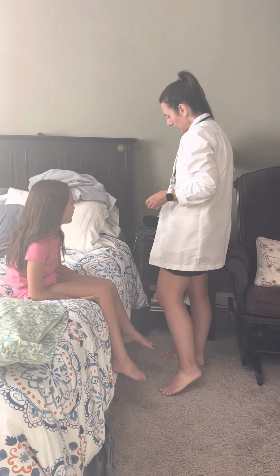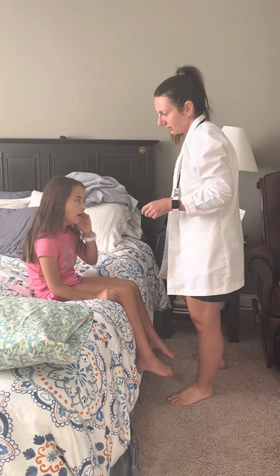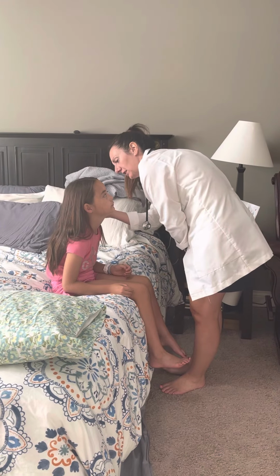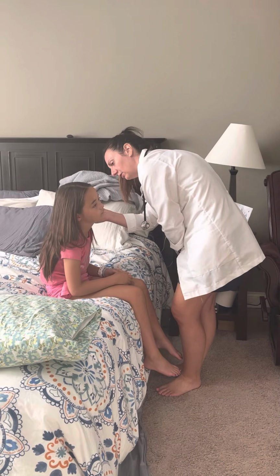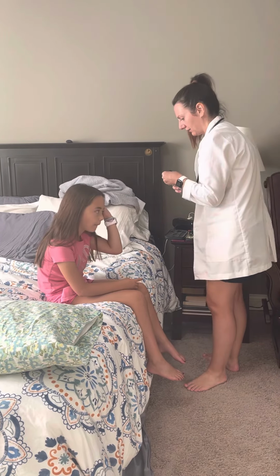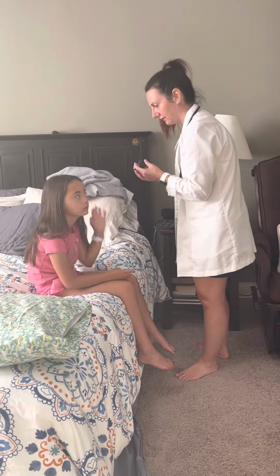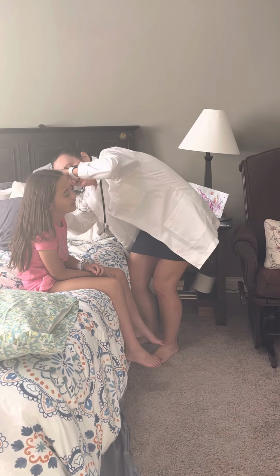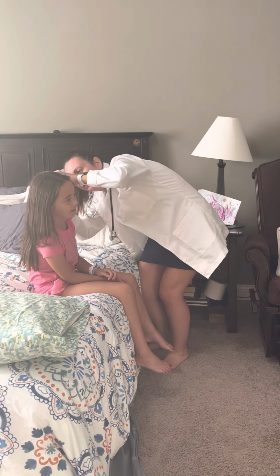And then I would look at her ear, and I again would look at the outside of her ear, look at the skin, and make sure everything looks nice. And then I would go ahead and look in her ear. Actually, should we do the hearing first? I'll look in the ear first, don't let me forget. And then we'll pull back on her ear and look in. I'll try not to hurt you. It's okay. You okay? Mm-hmm.